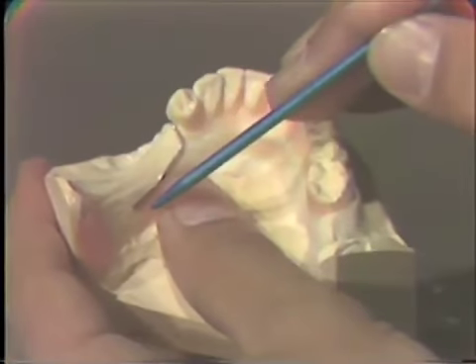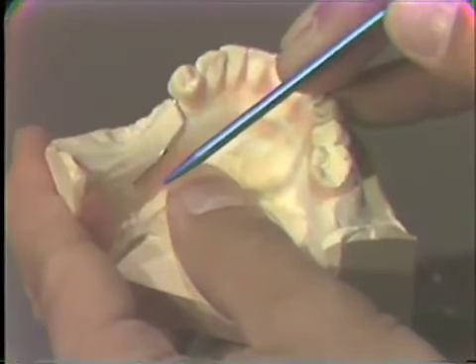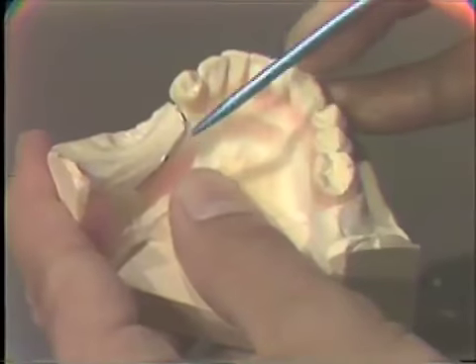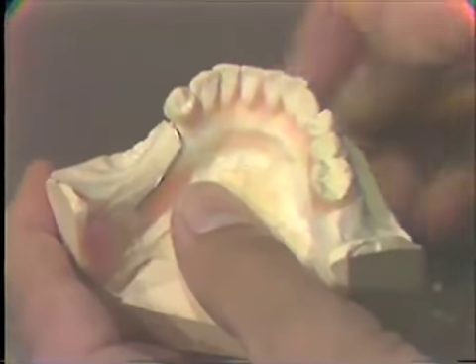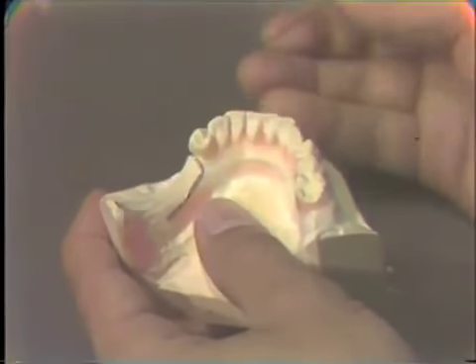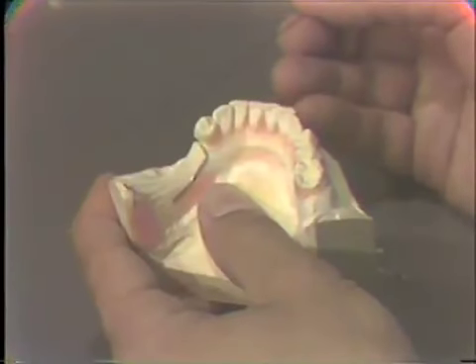See, the buccal surface is engaging an undercut area here, but the accuracy of the adaptation, particularly in the lingual area, does not have to be good, because we want acrylic to go under it to hold the clasp in position. Now, the clasp is made of orthodontic wire, stainless steel wire. Anything such as an 024 or even anything slightly larger than that will suffice. It'll be just a little bit more difficult to bend.